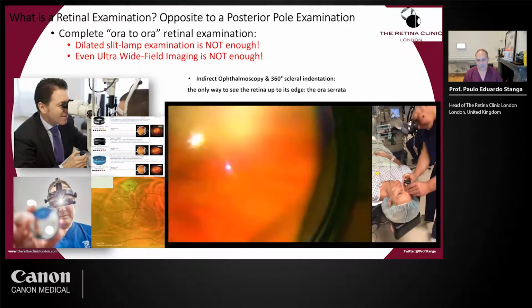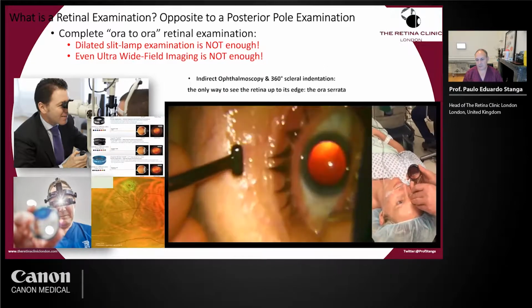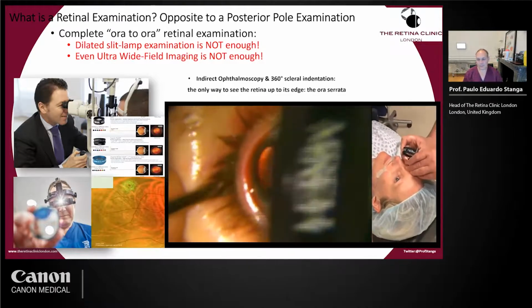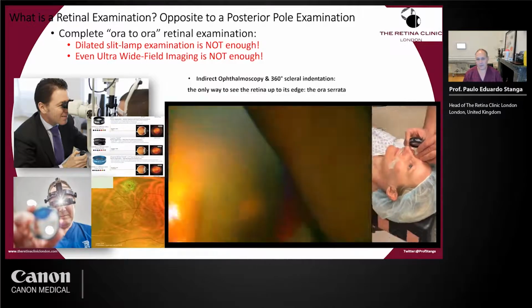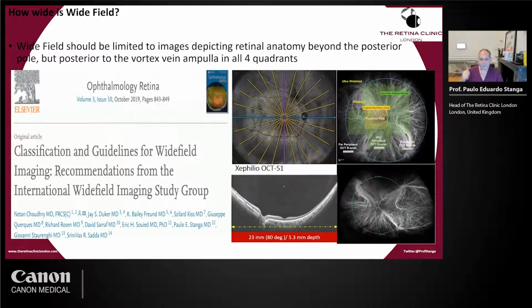That's a movie at high speed and very gentle pressure on the eyelid. I do this on all of my patients that come to see me with new onset of floaters or symptoms of PVD, and I ask them to recline on the bed below.